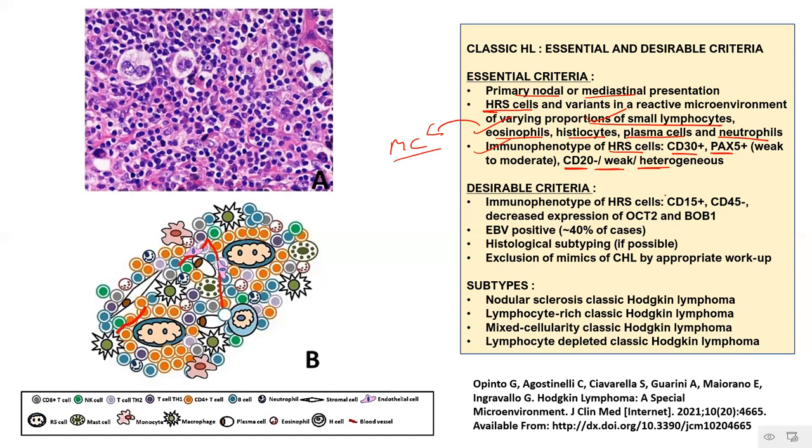The desirable criteria would be the famous CD15 antigen, which would be positive in again the same pattern as that of CD30.